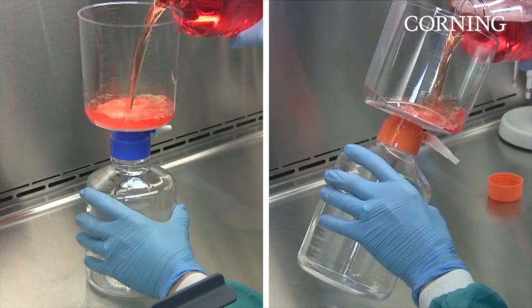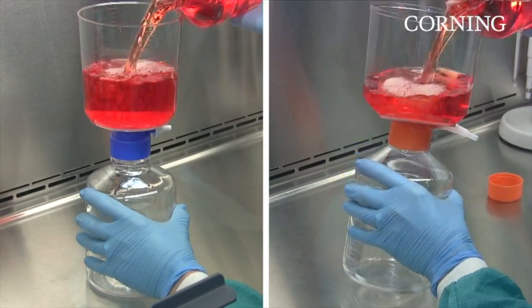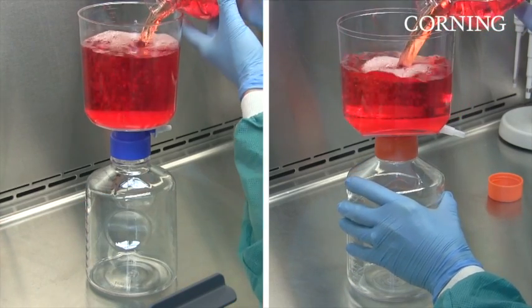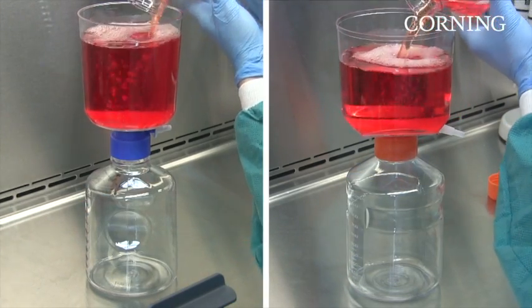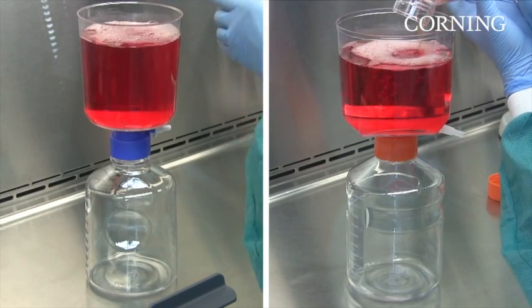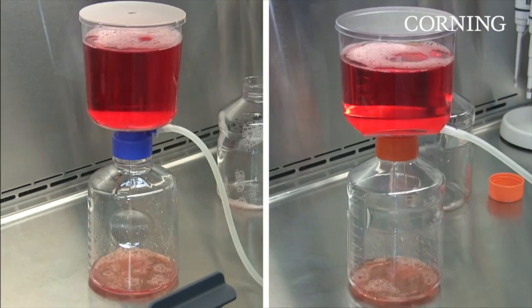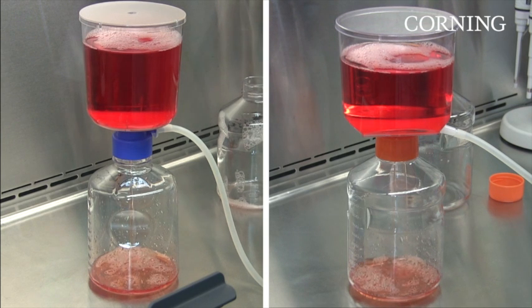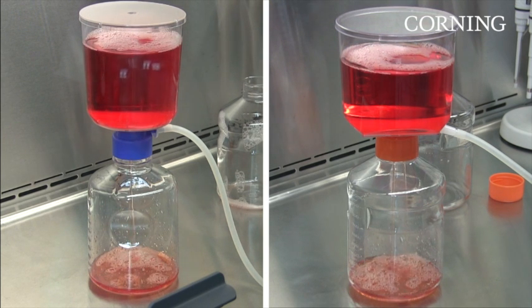To demonstrate the difference in hold-up volume, we will filter Corning media supplemented with 10% FBS serum through two different 1L filtration systems with a 0.22 micron PES membrane, one from Corning and one from another commonly used brand.